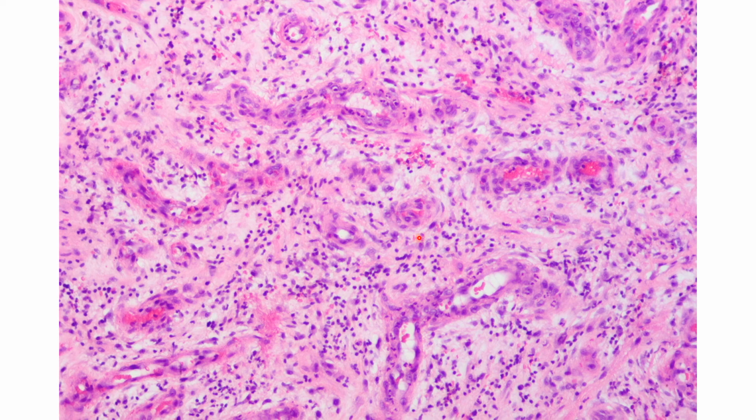And these blood vessels grow in the presence of all these spindle shaped cells, which are basically fibroblasts. And these fibroblasts produce this pinkish material, which is collagen. And most importantly, because this usually occurs in chronic inflammation, as I showed you in the gallbladder just now, you can see there are a lot of chronic inflammatory cells, predominantly lymphocytes.